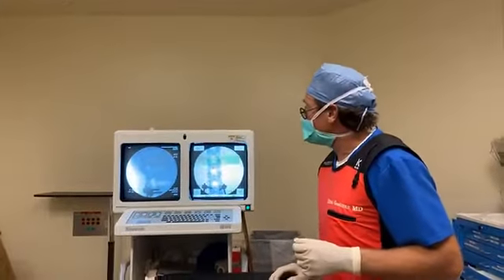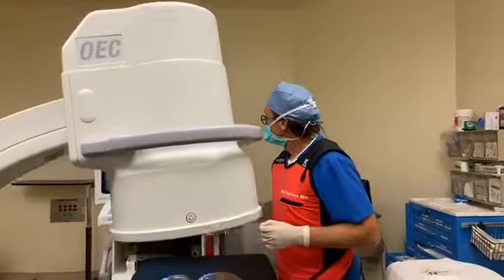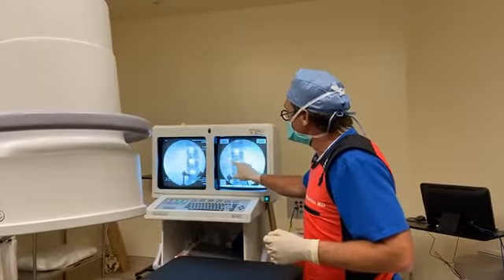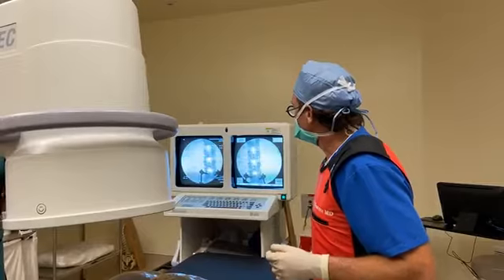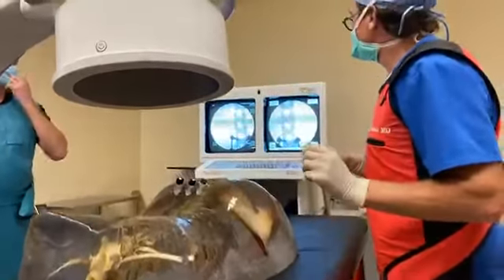Put it on the right. Let's go AP. So again, this needle's in the facet itself, and this needle was on the medial branch, so we didn't get our lateral on the right. And this is way too medial, so we're going to back this out, shoot it again.